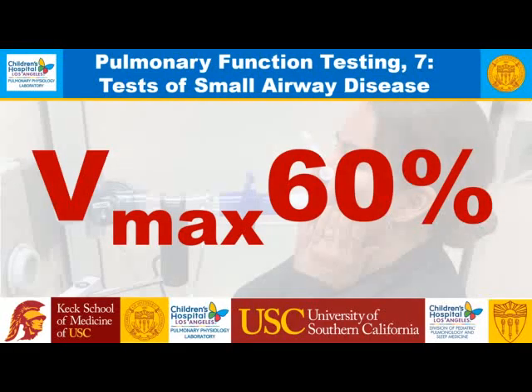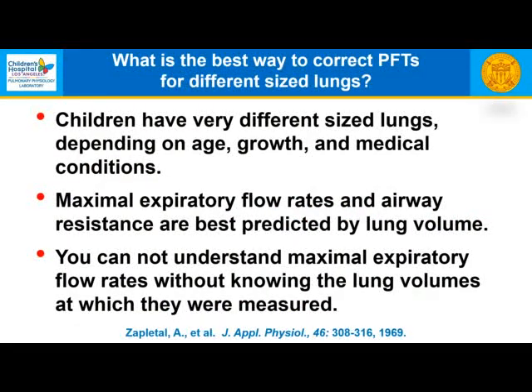So let's start. Vmax 60 we have discussed, but let's just do this again to remind you. Children have very different sized lungs depending on age, growth, and medical conditions.